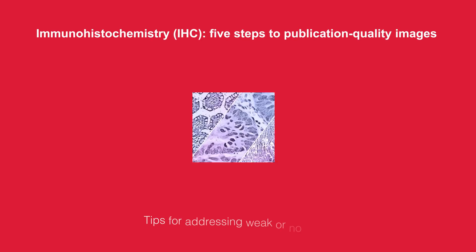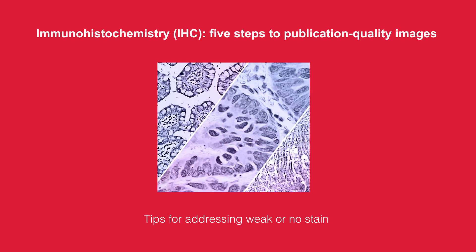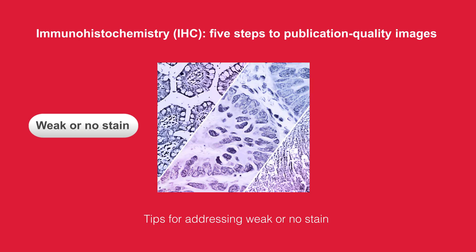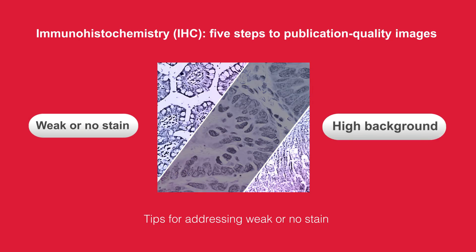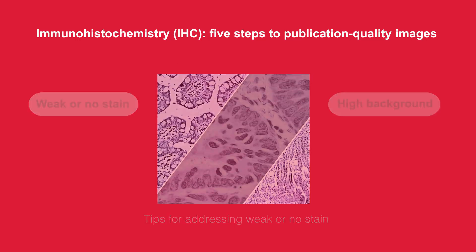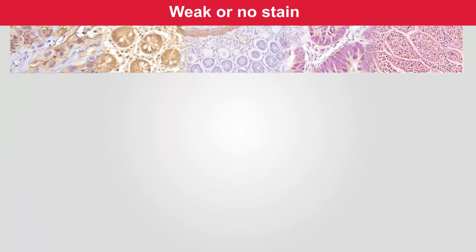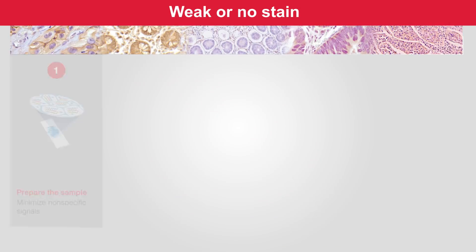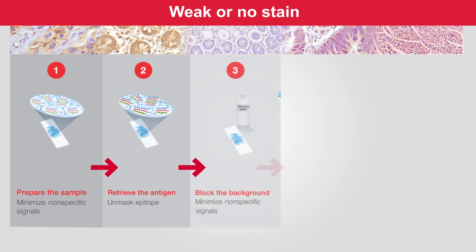Immunohistochemistry, or IHC, offers spatial visualization and location of an antigen in tissue sections. This application can be challenging, with problems generally falling into two categories: weak or no stain, and high background. Here are some troubleshooting tips to address weak or no stain for each of the five steps for successful IHC.